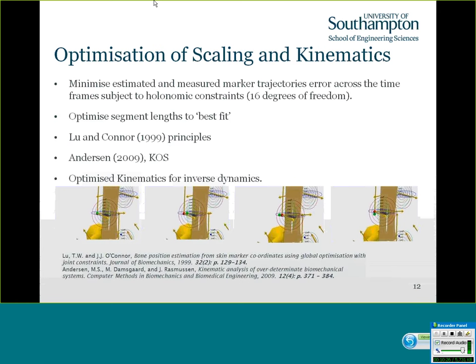And when we have our scaled model that's got the patient-specific anthropometrics, the markers, and the muscle model, we can then start to look at modeling the actual movements. And now in AnyBody, the application is a very easy process in which you can take the C3D data from the Vicon system and plug it straight into the model with your preset patient-specific model.